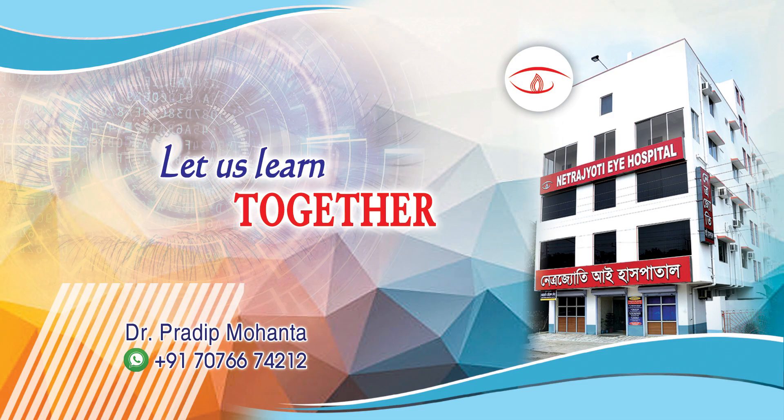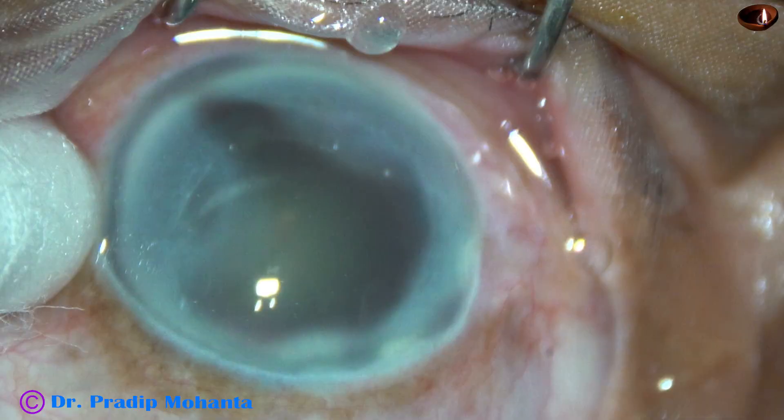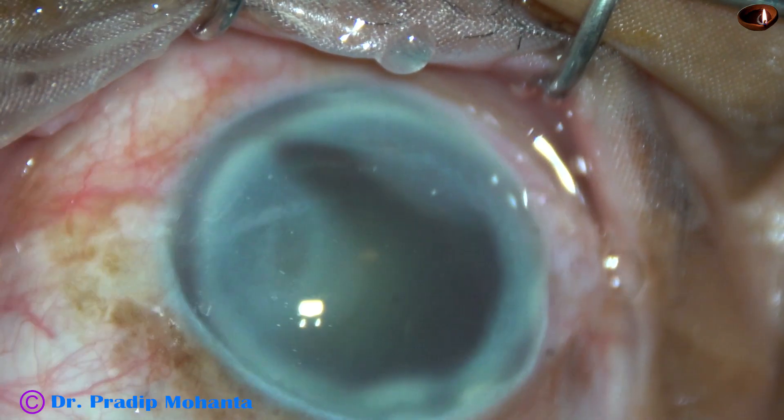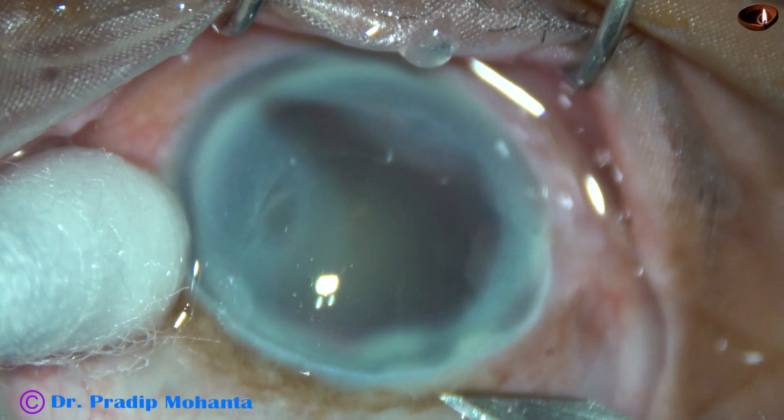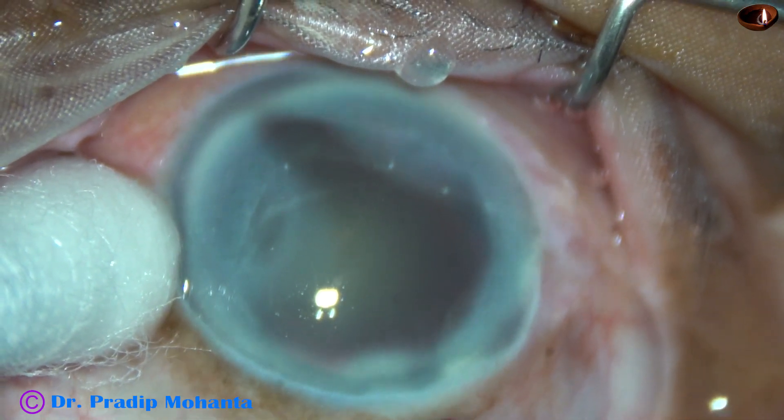Friends, welcome to my workplace at Ranaghat, West Bengal, India. This is a cataract with corneal opacity and dense arcus senilis. And there is probably some scarring at the limbus at various places.